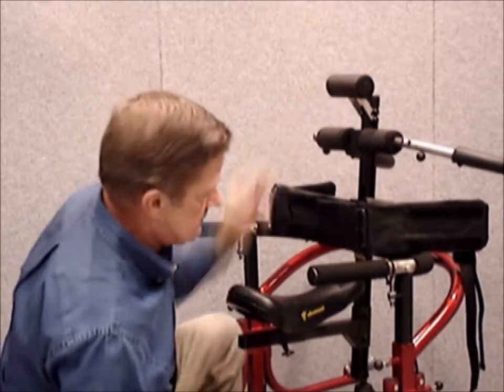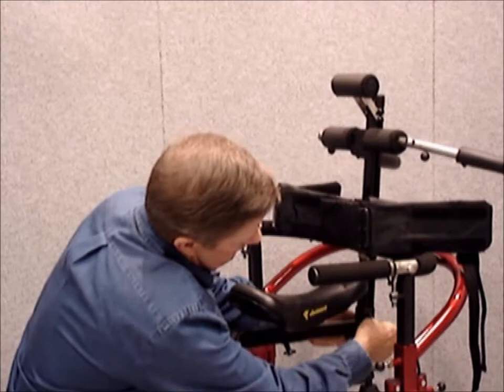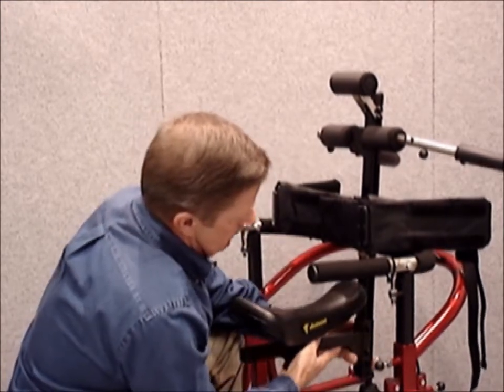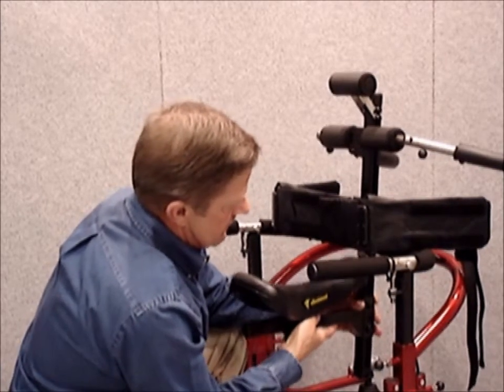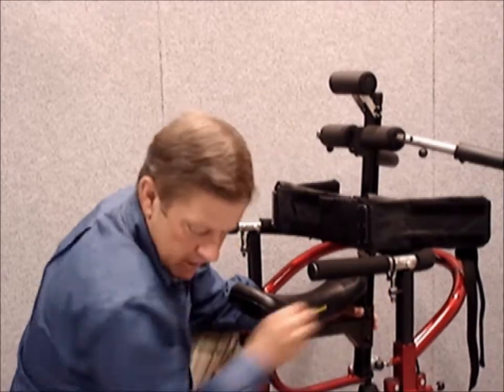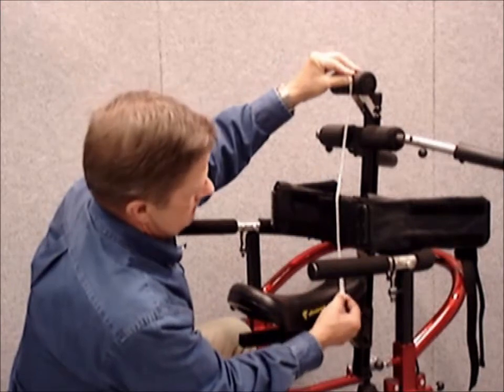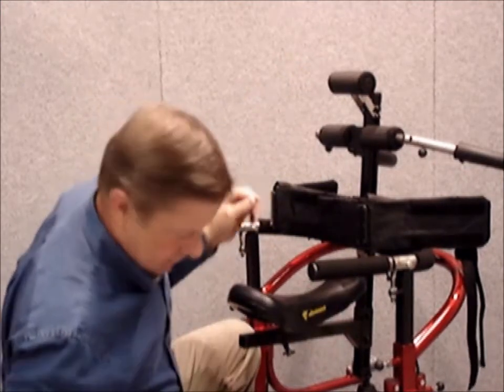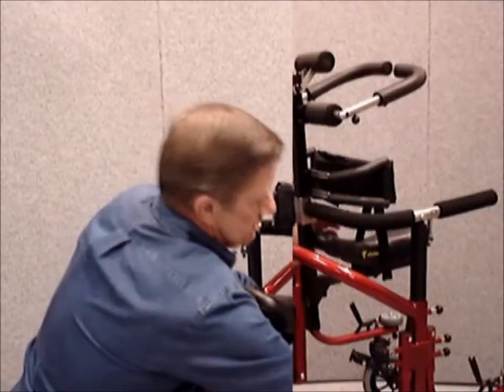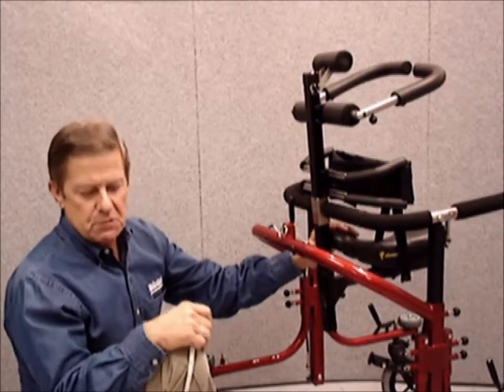To accomplish your desired height, loosen the 2 Allen screws on the seat rail. Raise and lower to your desired height. Check your measurement. Then make sure both screws on the rail are securely tight. Measure the user's inseam. That is number 1 on your measurement form.